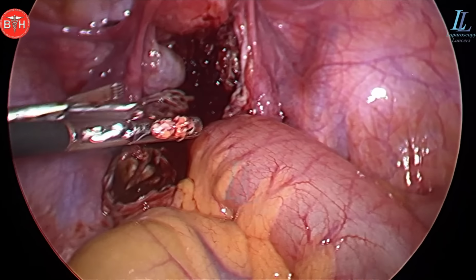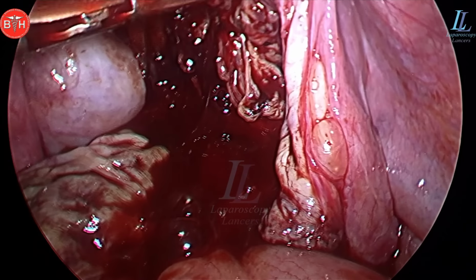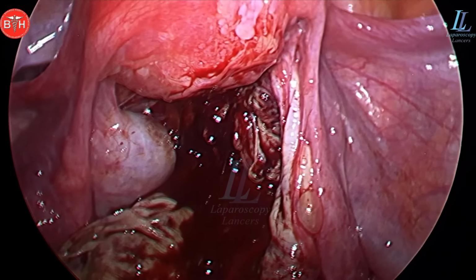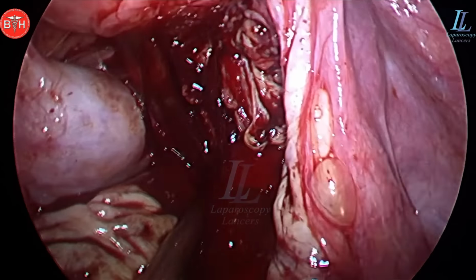Hello, that's the 2 cysts. Now a bit of inspection again, and I'll be sucking this out. As you can see, no pink blood, that means no fresh bleeding is there. That's a bit of ooze. You do not need to worry about it. Just suck it a bit.